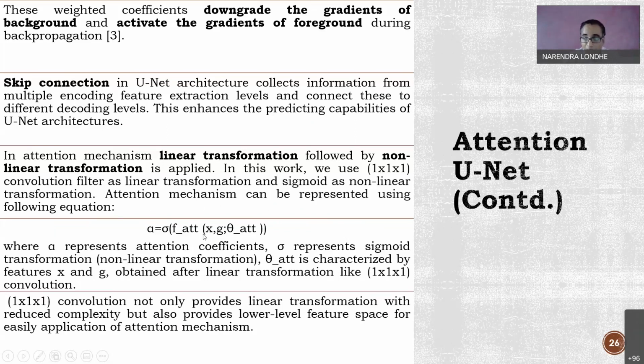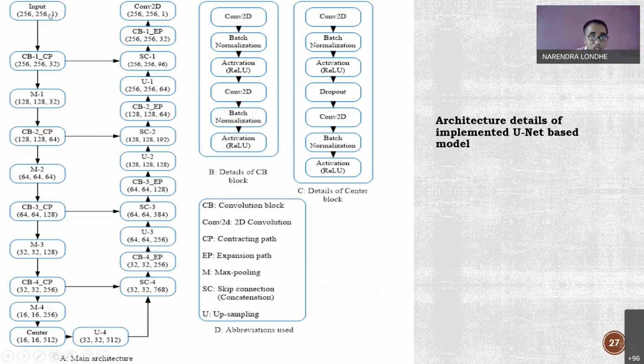Okay, and now this is the structure of the U-Net. You just see U, this is the shape U, right? This is your input, then there is a convolutional layer, then a max pooling layer, convolutional layer, max pooling layer, convolutional layer. So there are multiple convolutional layers in this encoding path. Then here at the center there is a layer. Once you come to the center layer, after that the decoding path will start. This is the upsampling. So here I was doing the downsampling. This max pooling is nothing but the downsampling. But after the center layer, I'll be doing the upsampling.